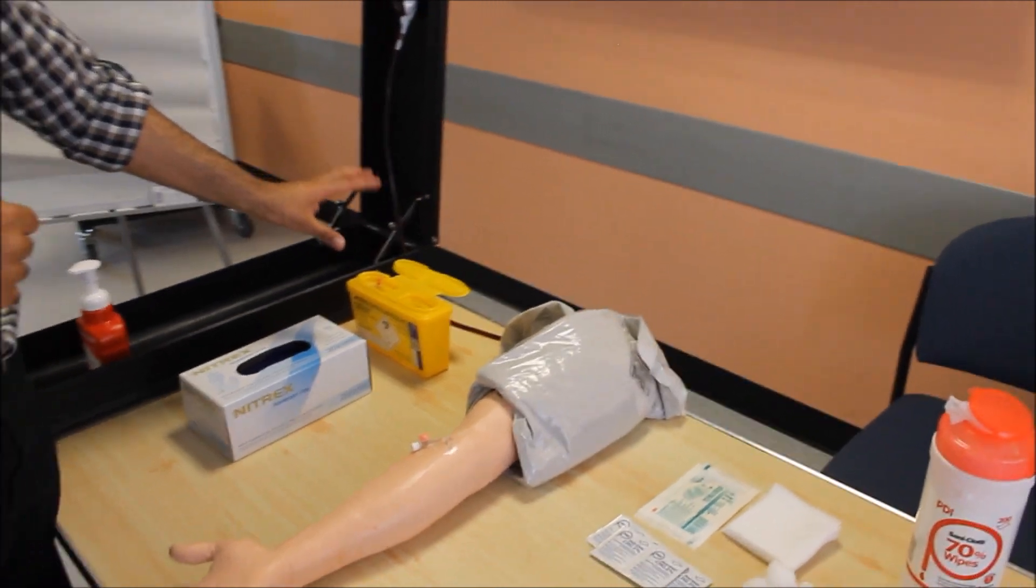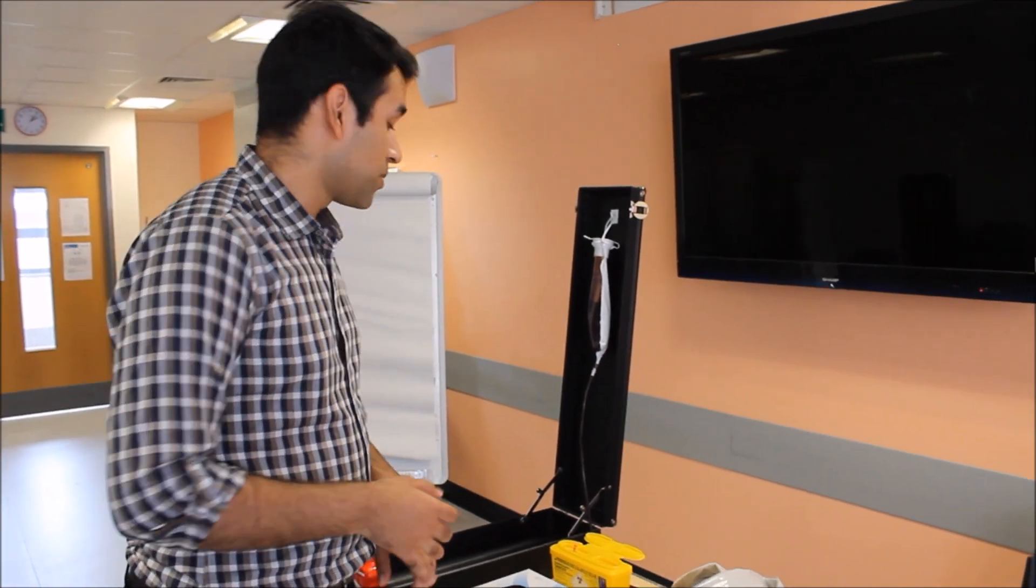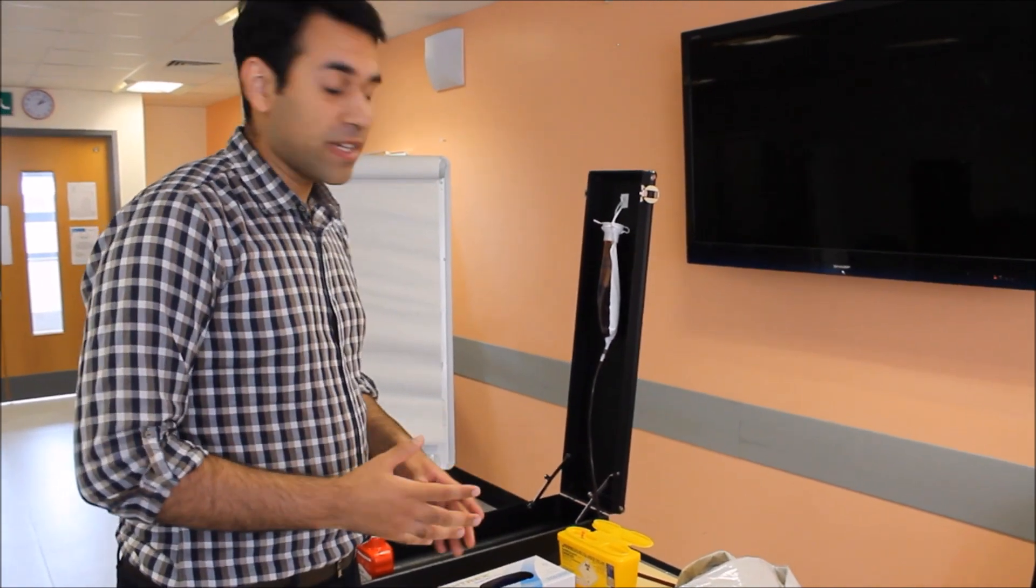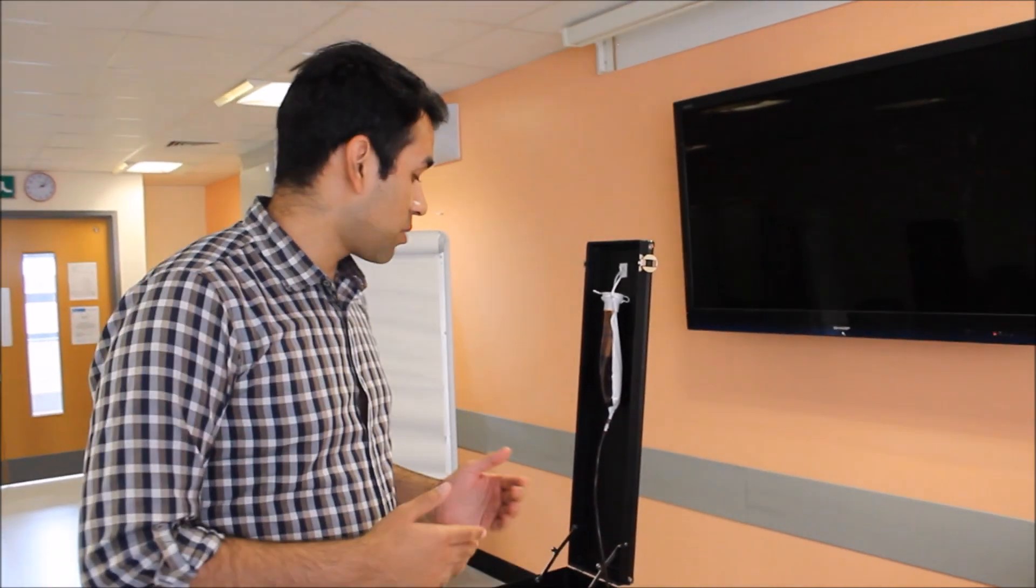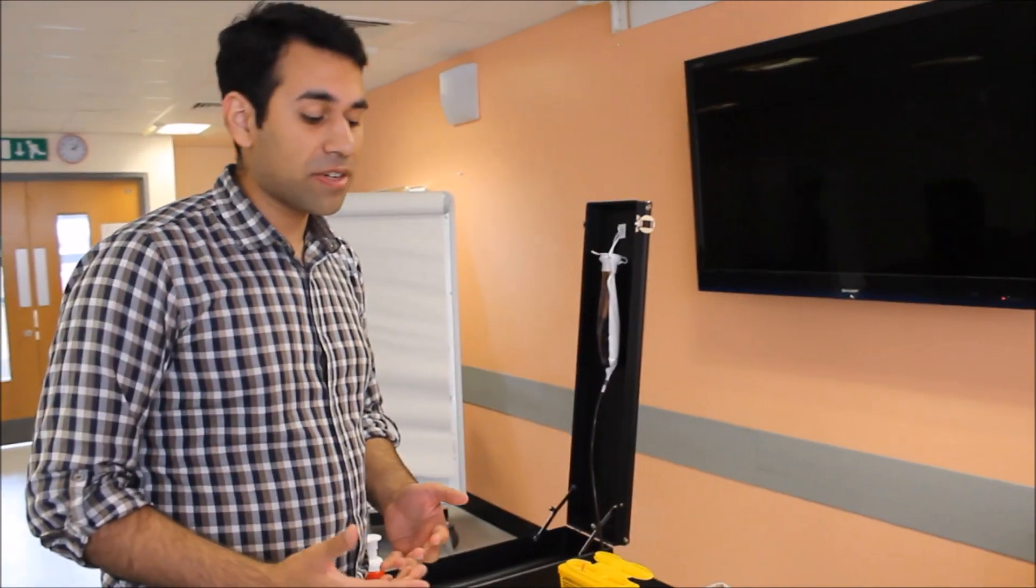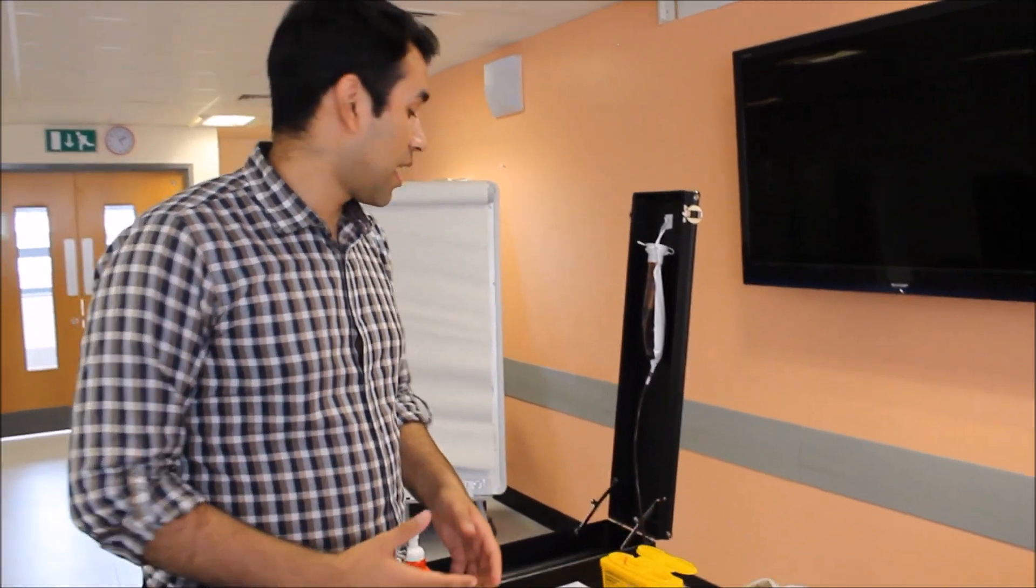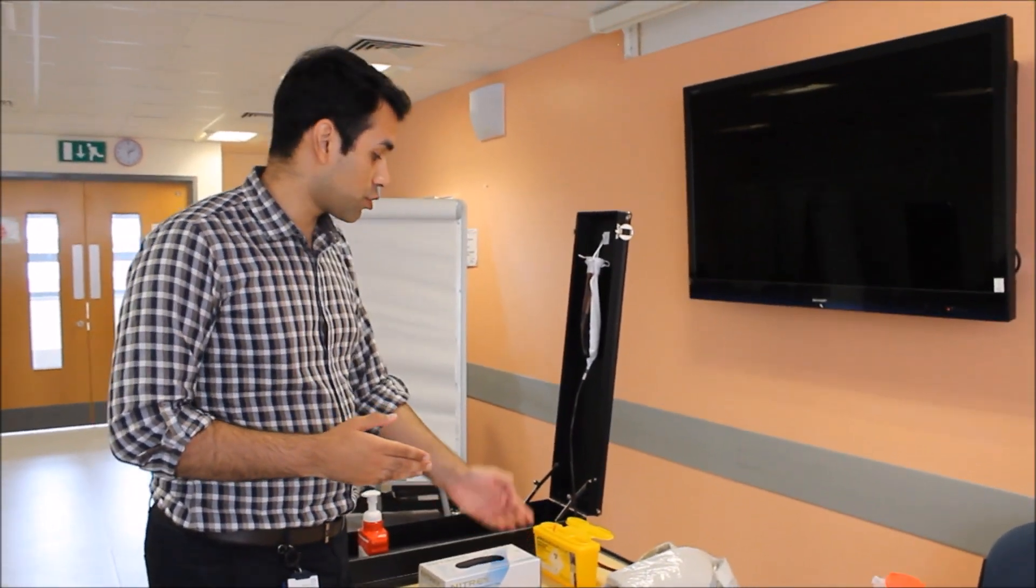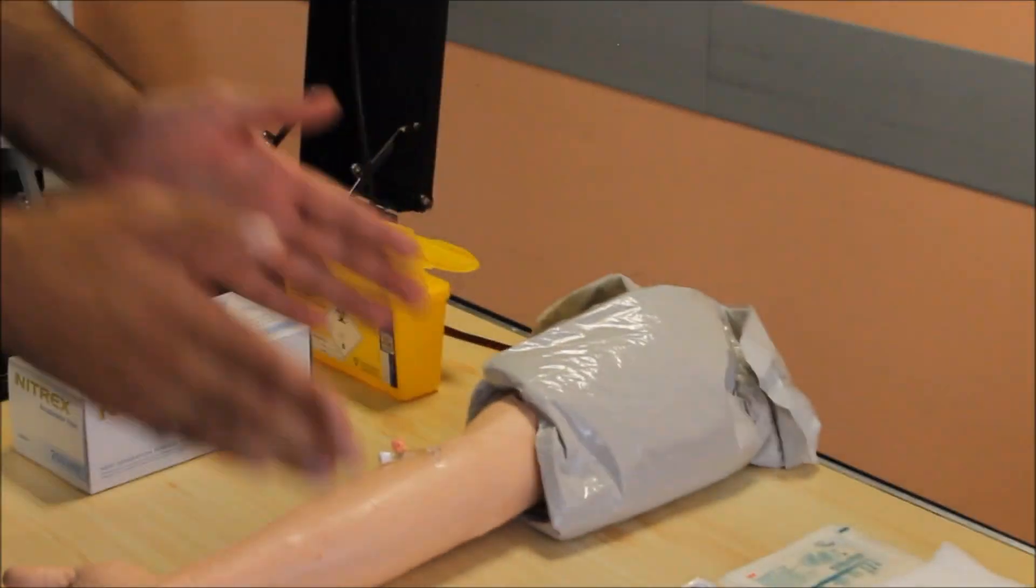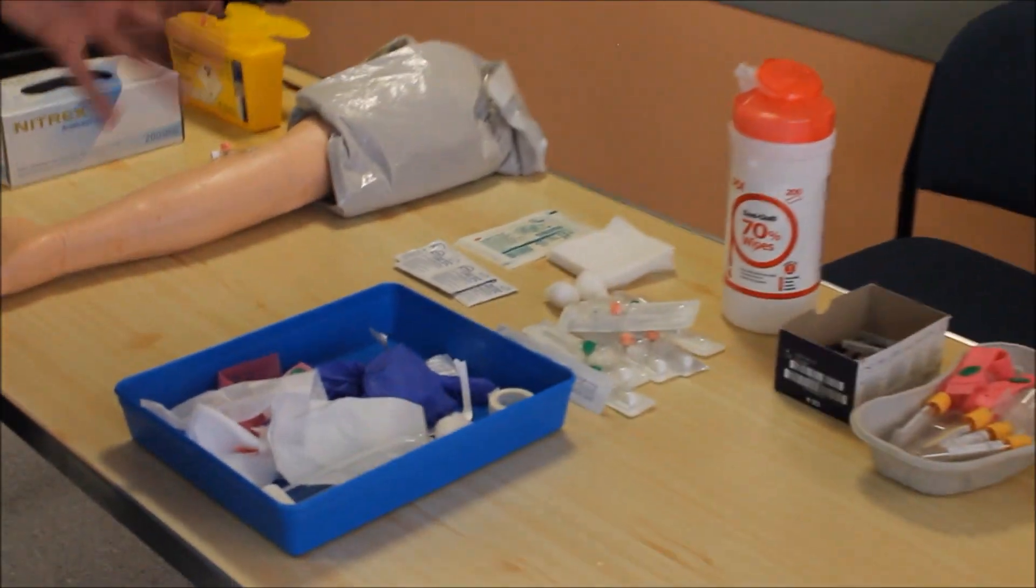If you do not put your sharps in the sharps bin, for medical students you will fail this station. But in general life, it's very harmful for other people. It's a risk to other people. Other people can have needle stick injuries. You yourself can have a needle stick injury if it's lying around or forgotten somewhere. Blood can spread all sorts of disease. So it's very important that you always put your sharps in the sharps bin and always clean the stuff that has been left in the tray should be put in the clinical waste bin. Thank you very much.